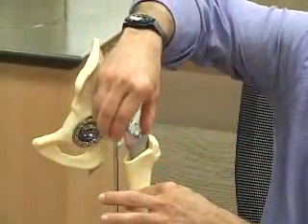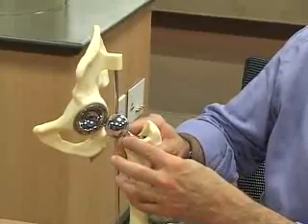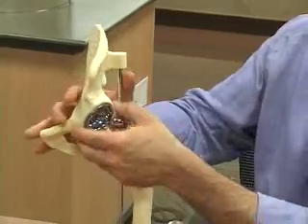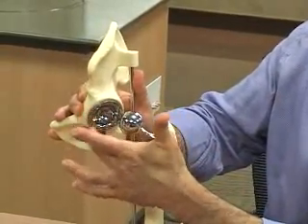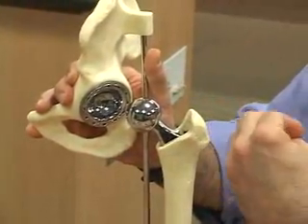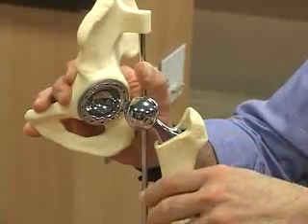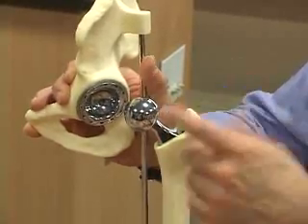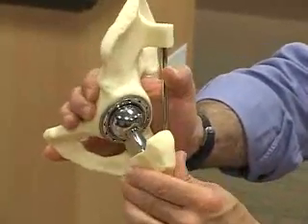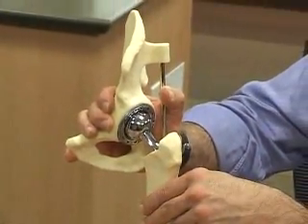Then you insert the new prosthesis into the bone. So we have a new metal neck of the femur and a new metal ball of the femur. And then the pelvis, which has a bony socket — the shape of the socket, which is normally oblong — is shaped with an instrument that looks similar to a cheese grater. This is made round, and we put a new metal socket in. And then the ball articulates with this new metal socket, very similarly to your own natural hip.